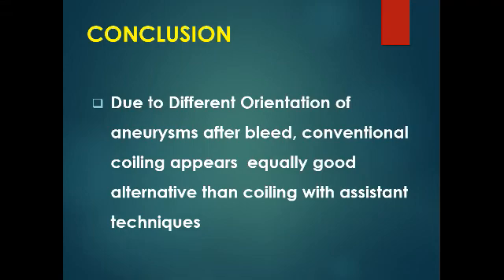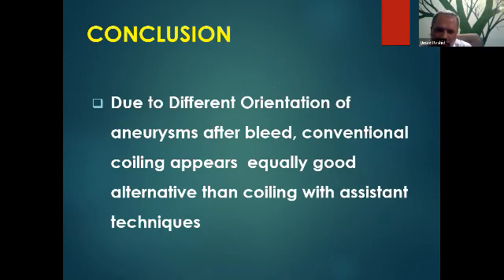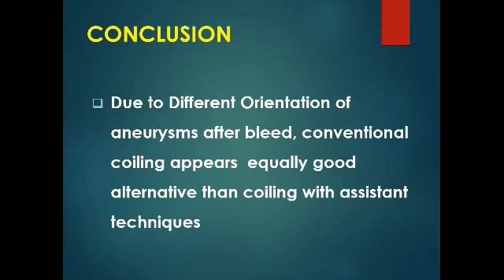Okay, and do you use the double microcatheter technique often? Do you consider this also a simple technique, or a special technique? In fact, I just modified that technique. Yes, I used to do double microcatheter, but in these sorts of cases, where we feel we can easily access with a large caliber microcatheter, it plays like a double catheter technique. It gives you some surrounding, shortening the neck of the aneurysm. So if you make the first curve of the coil safely, then it becomes very easy to do simple coiling with the larger caliber catheter. Otherwise, I don't use the double catheter that much now. Okay. Thank you.